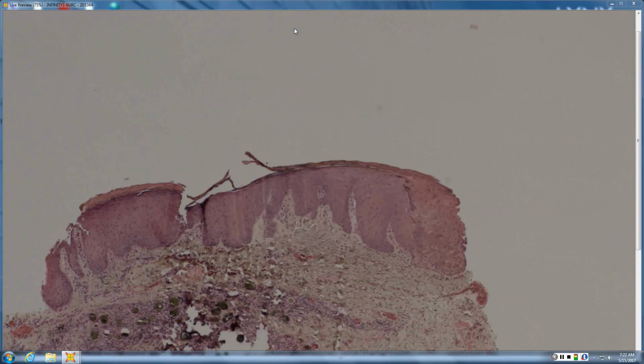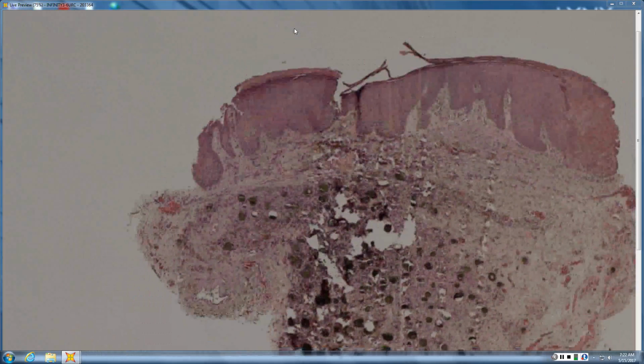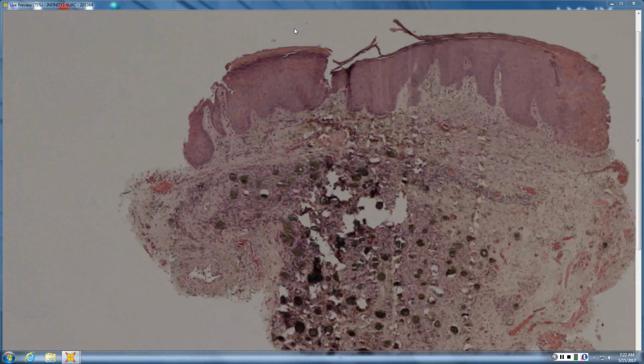And the last one, this is basically Radiesse, calcium hydroxyapatite, and certainly you can see that there's something going on here in the dermis, and it's all these little round, kind of calcified looking things that are very much refractile. Especially as you get closer in here without the condenser.